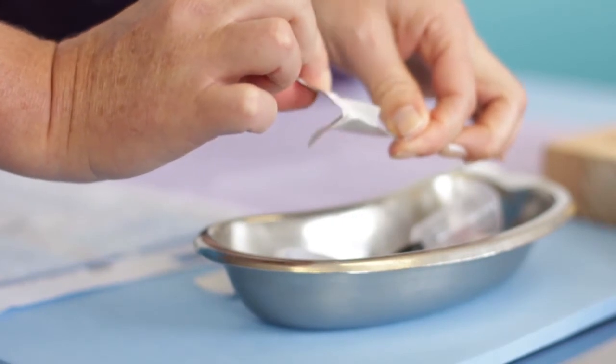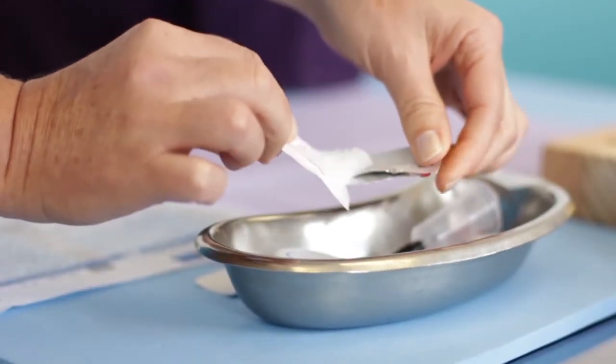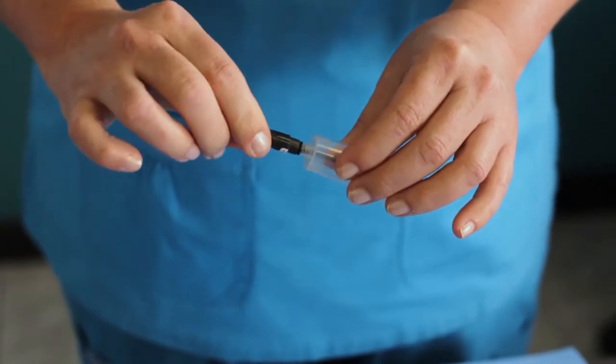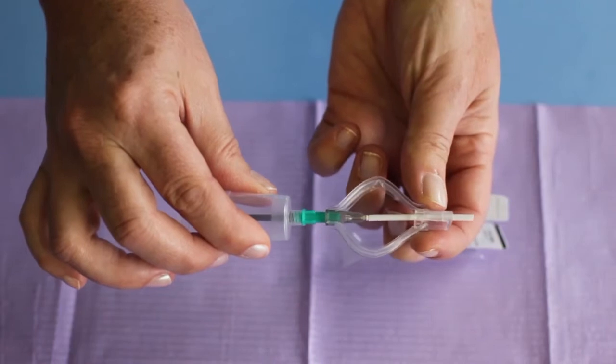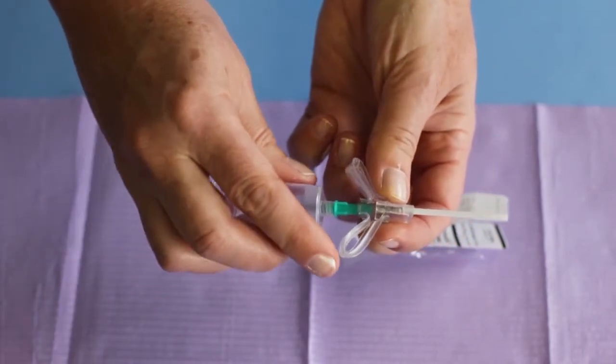Tear open an alcohol prep swab sachet. Attach the vacutainer needle to the vacutainer hub or use the AutoSafe safety vacutainer phlebotomy device, which has a safety needle preassembled to the hub.